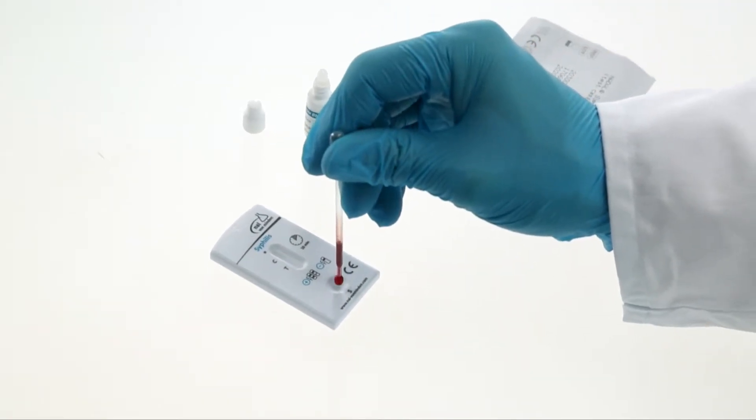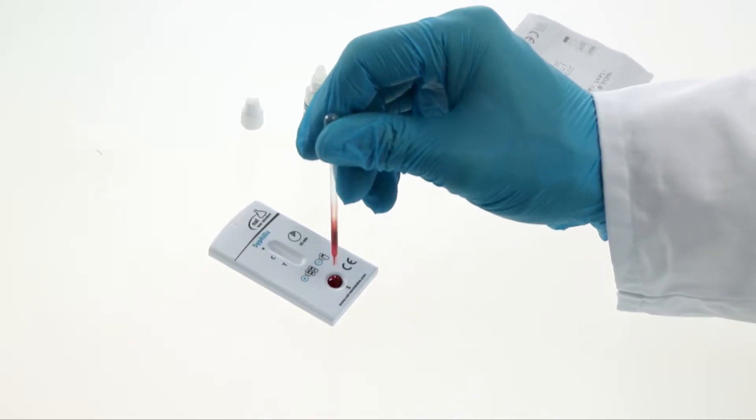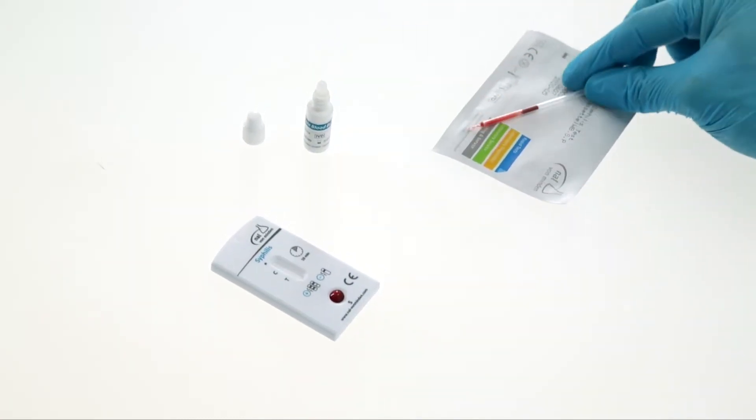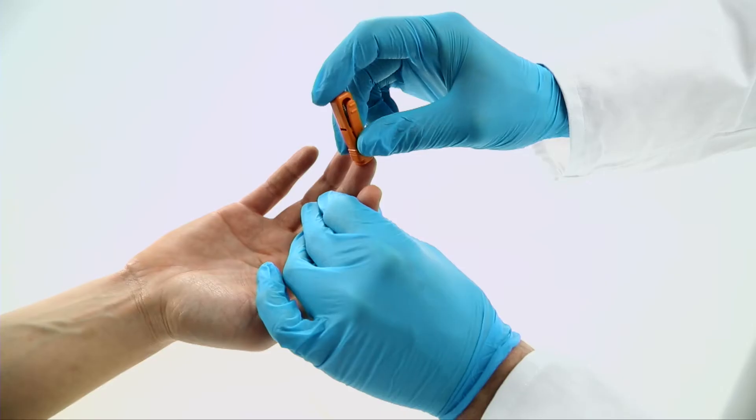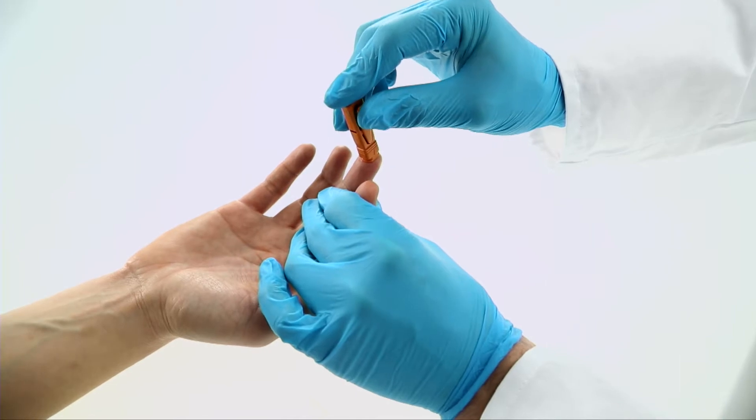Holding the pipette provided vertically, dispense two drops of whole blood sample to the sample well of the test cassette, then add one drop of buffer. You may also use blood obtained by finger stick.